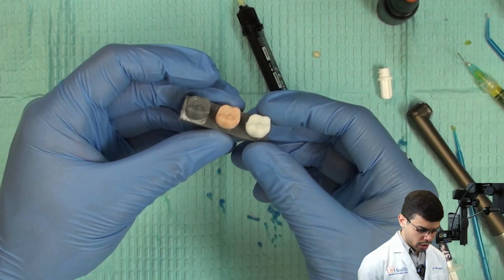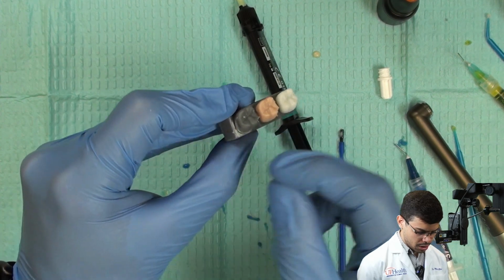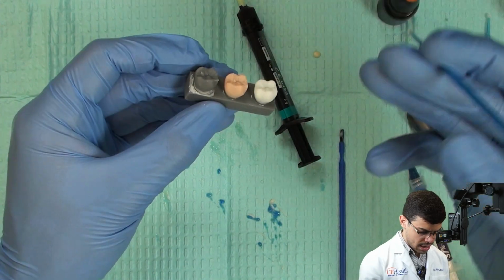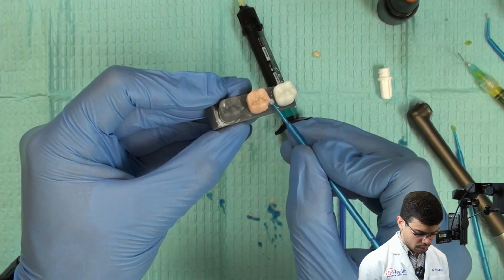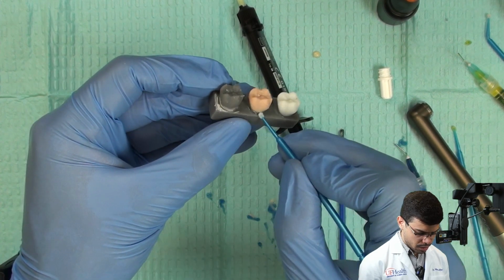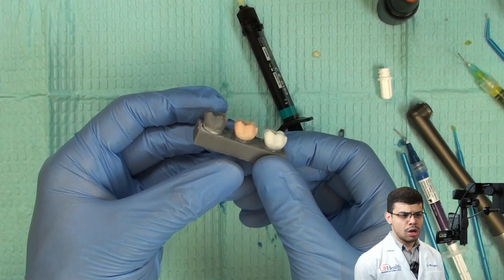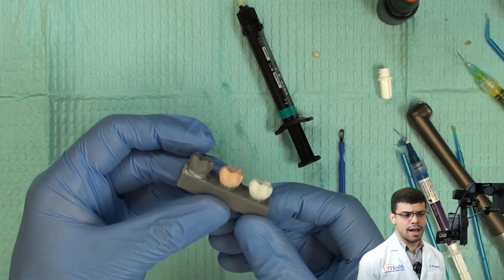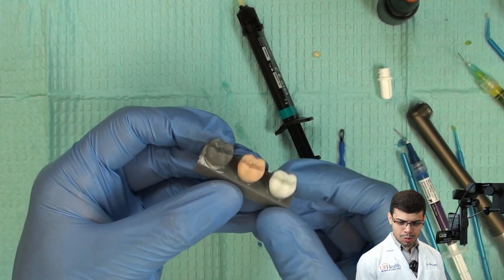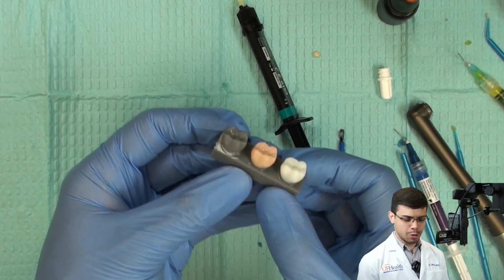Okay, so you're gonna show this to your faculty, okay? You see a little bit of excess of glass ionomer here, so you can go ahead and clean. You can put a little bit of water and clean the rest of the excess of cement that you have. Make sure that everything is clean and nice. So you show your faculty, who will grade you and also talk with you about the decision that you had for the protocol. And after you're done, you can save this as a souvenir, take a picture, put on Instagram, just tag Dr. Oliveira on it.